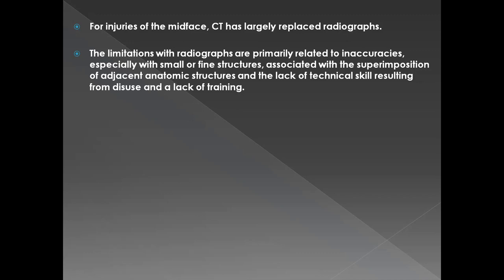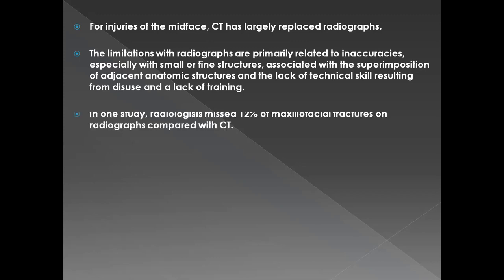Also, there is usually a lack of technical skill, which can result from disuse and a lack of training. Basically, the radiographers that you have over here are not maxillofacial radiographers, so they might not be taking standardized X-rays, and the X-rays that the patient comes to you with will obviously then be diagnostically unusable.